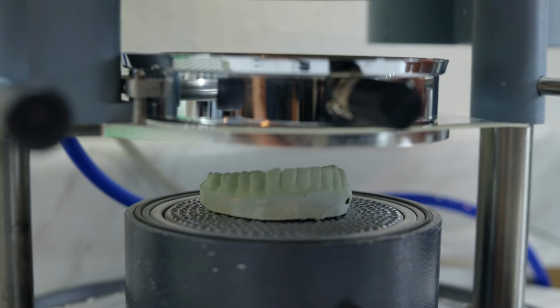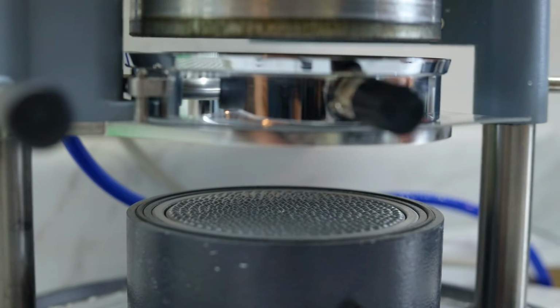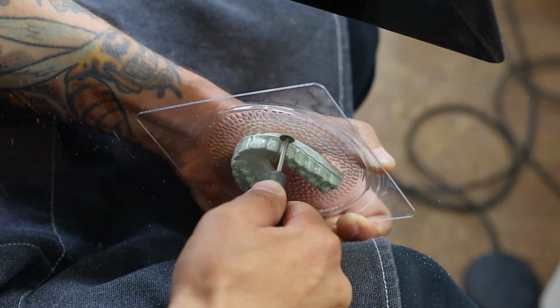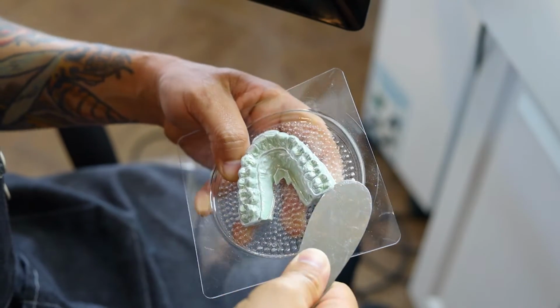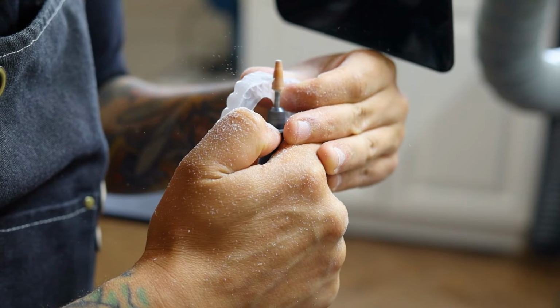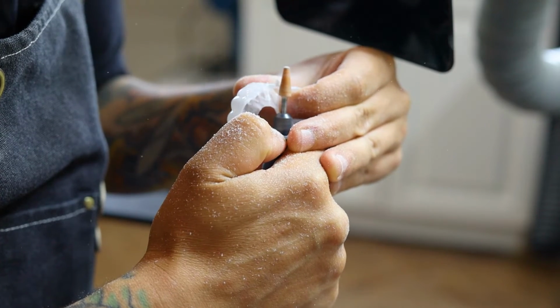This computerized machine combines high heat and pressure to thermoform the night guard material over your stone cast. Once the mold is properly cooled, it's time to trim, shape, and polish your night guard. This step is very important because the fit needs to be perfect. We want your guard to fit like a glove, not too tight, not too loose. Your custom night guard should stay in place and feel comfortable in the mouth.